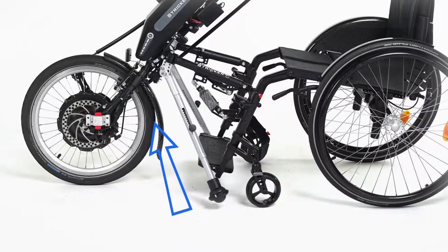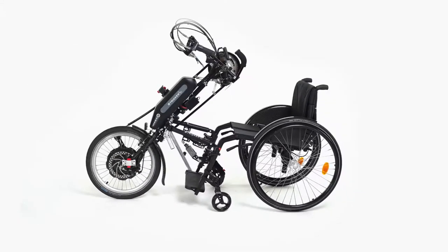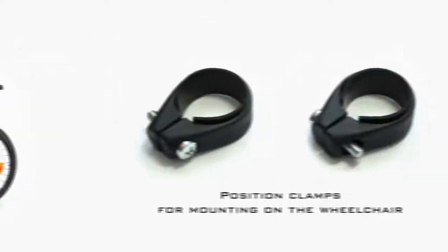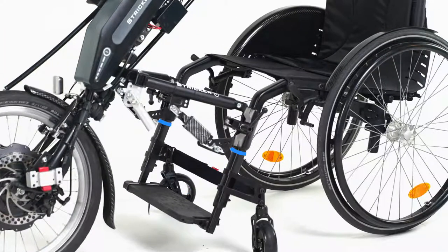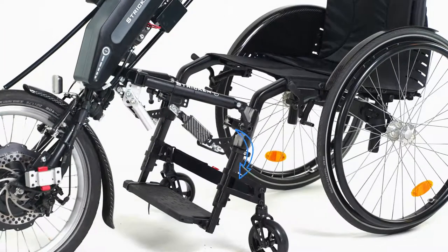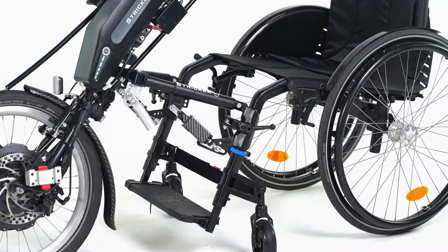To remove a kickstand, shorten its length, press the button on the back of the stand and pull it out and downwards. Use the positioning clamps supplied and fit them under the clamps on the wheelchair frame. During the coupling process, the handbike can simply be placed on the positioning clamps and is then always at the same height.